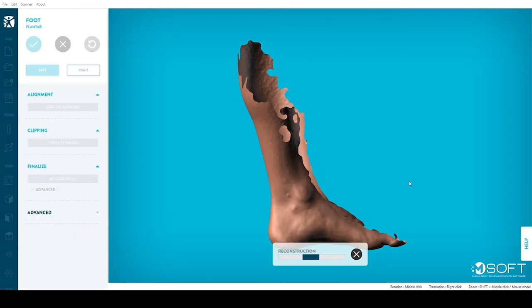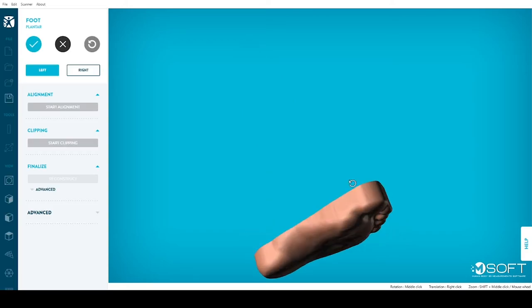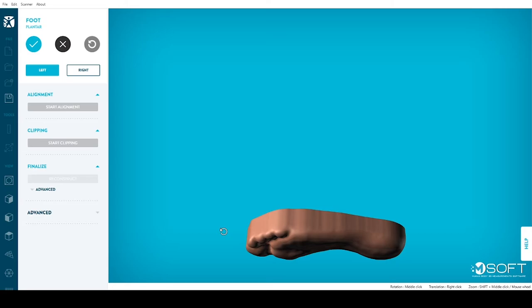Reconstruction is the automatic process in which M-Soft will smooth your model to create a clean, watertight result. M-Soft will do the work for you in only a couple of seconds.